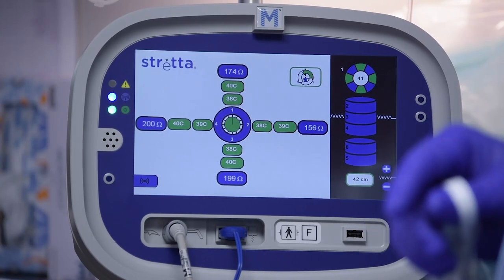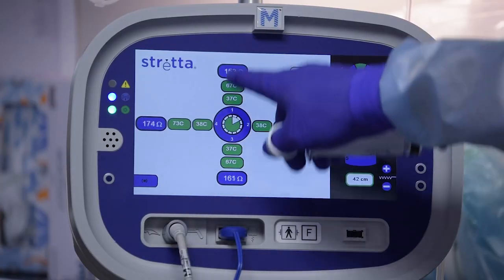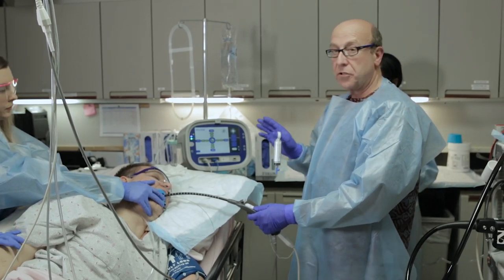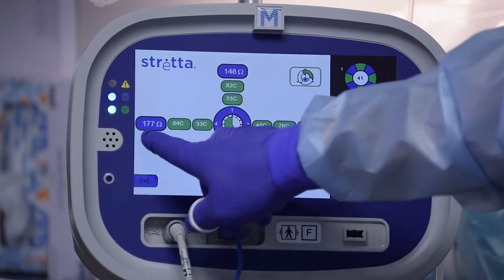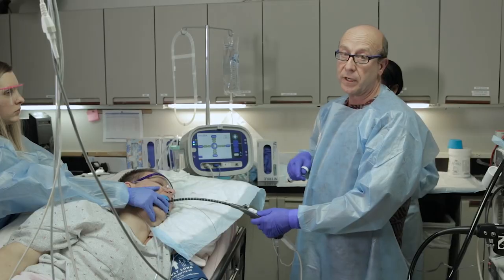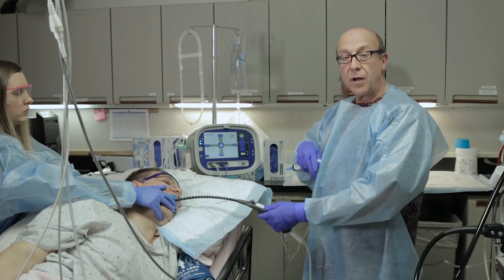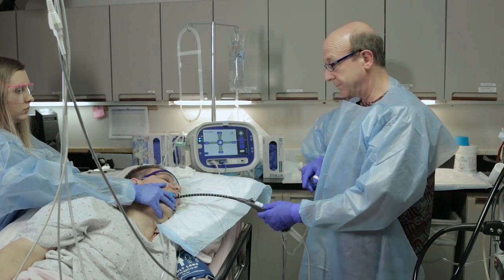We look at the monitor at the outside numbers, which are impedance numbers telling us we're in the muscle layer — that's what we're trying to treat. The lower the number, the more muscle we're treating. We simply step on a foot pedal and that starts the radiofrequency waves entering the muscle. There are four arms, each representing an individual generator, so there are four needles each with its own generator — if one malfunctions, it just shuts that needle down. The temperature at the tip of the needle should be between 65 and 85 degrees centigrade, roughly the temperature of a cup of tea or coffee.